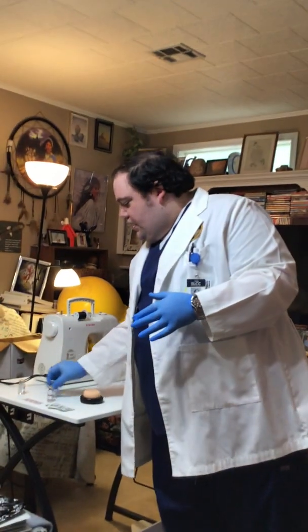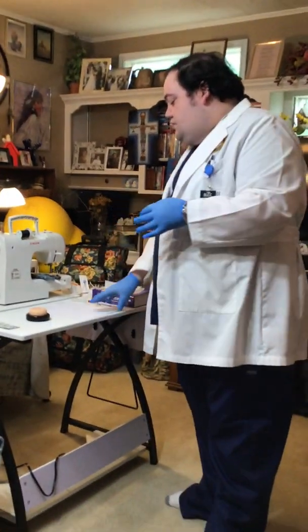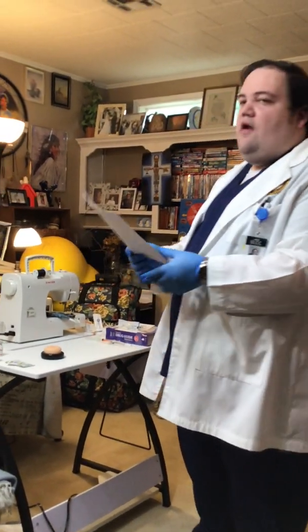So we're going to come in here, and the first thing we're going to do, introduce ourselves. Hi, my name is Kenneth. I'm your nurse today. And the doctor has some medication, some shots for you. Would you mind if I give you your medication? We're going to get consent from it. All right? We're going to have our order in our face again, because even at this point, there's a chance we could have made a mistake.